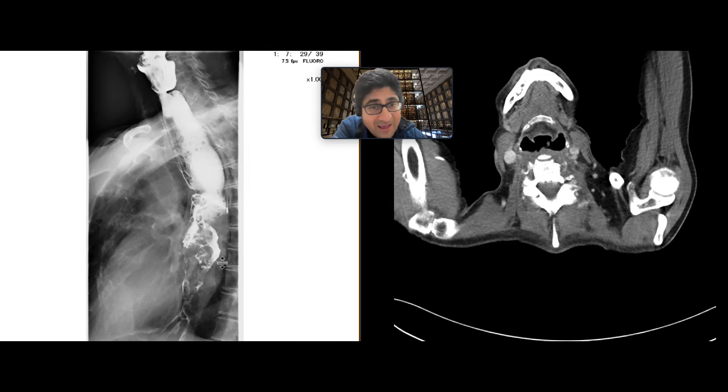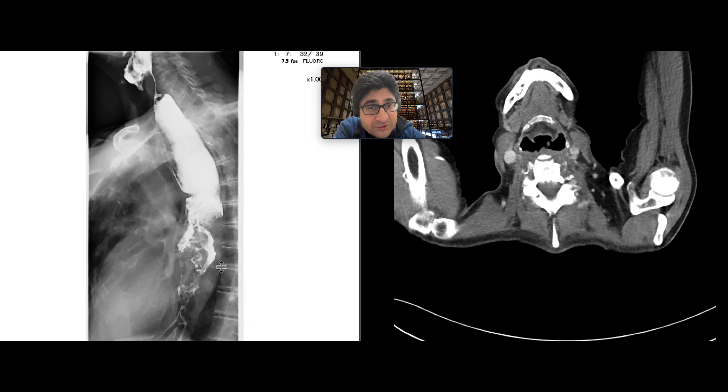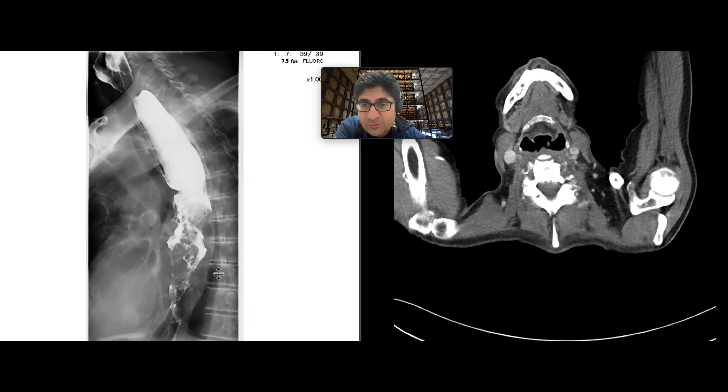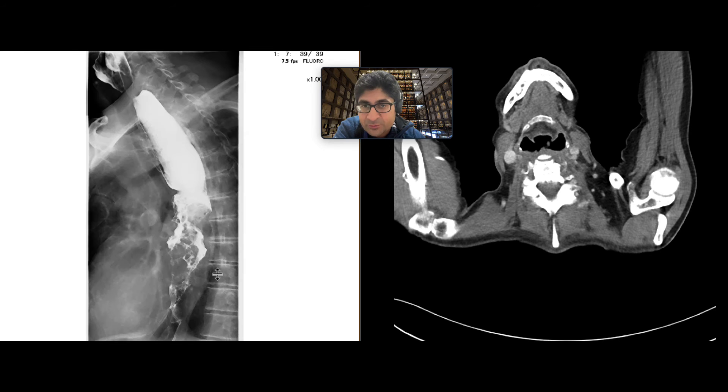This is a great look for esophageal neoplasm — common ones being common: adenocarcinoma, and potentially squamous as well. That was certainly the thought process here.